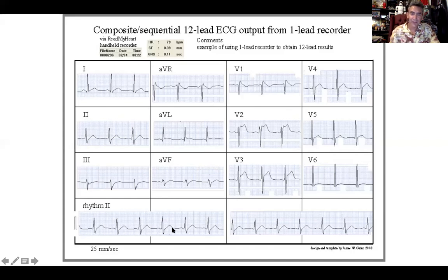This ECG looks a lot cleaner. Little P wave, Q, R, S, T, very minimal P, Q, R, S, T. So again, the rhythm strip of 2. So this is how you would attack your ECG problems here.